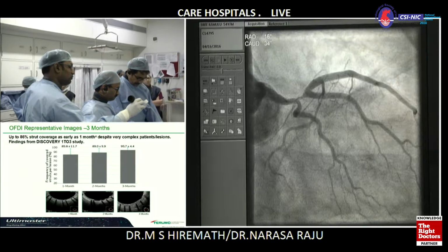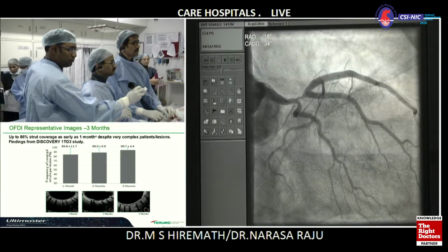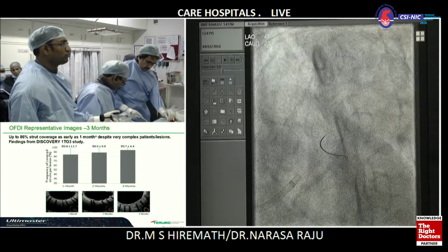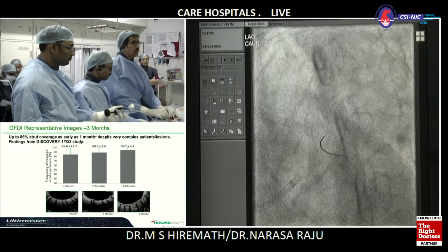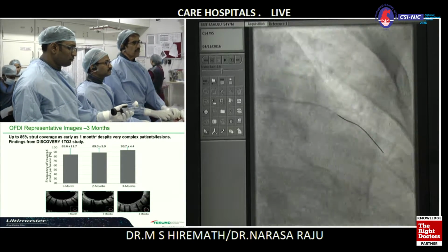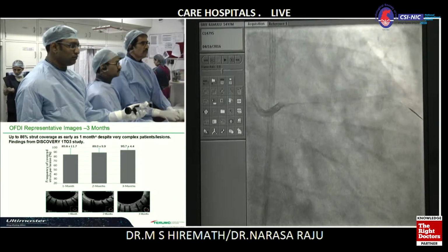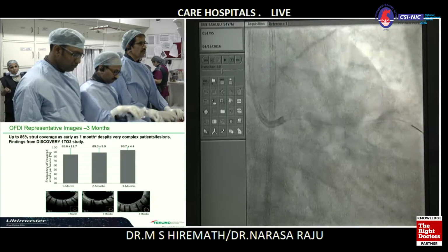This is Rajiv Lochan. What's the length you have chosen, and what's the diameter of the stent? So we have 4×24. The IVUS actually indicated the length of the lesion was 17. So we have enough length on either side.